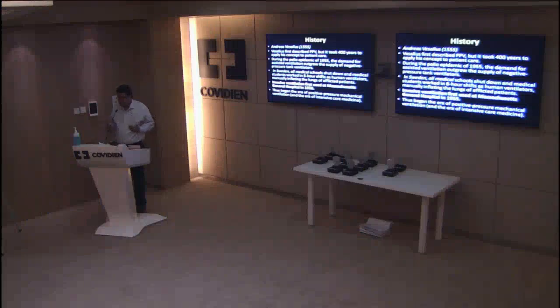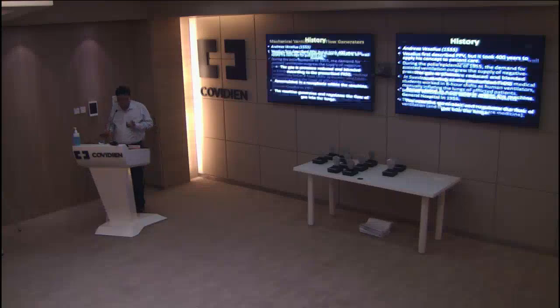Formally, positive pressure ventilation began at the MGH in 1955, and with that, so-called intensive care also developed as a new specialty. For most circumstances nowadays, we have positive pressure ventilation, which basically means that you create a positive pressure at the mouth, so that air moves because of the gradient between the mouth and the lung, and therefore air moves from the mouth into the lung. That is positive pressure ventilation, which most of us now deal with.